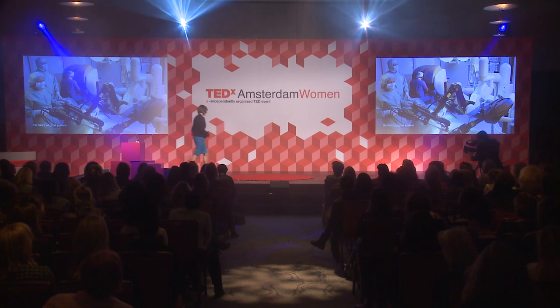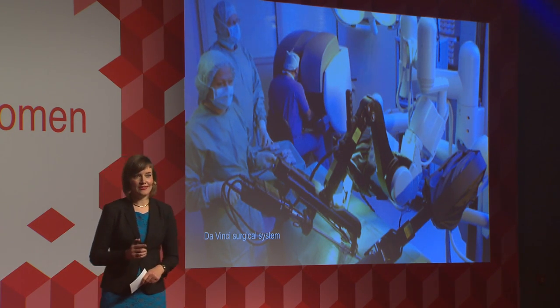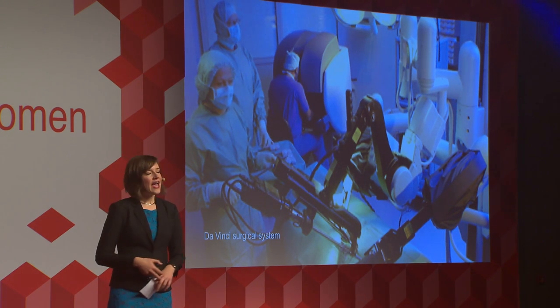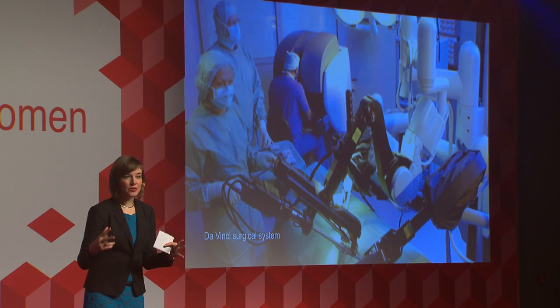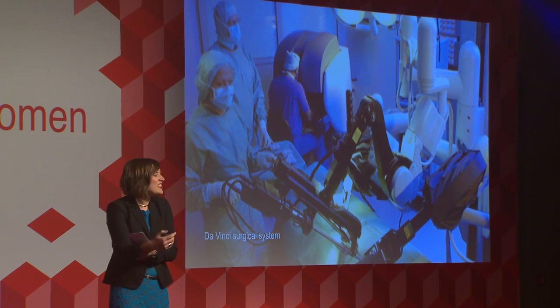Sorry for that. So I got this information, I went back to university, and I studied it. And I found that we needed to reduce operating time, because that would give more patients and surgeons the possibility of actually using these benefits. And the resulting design goals to reduce this operating time were three. One, we should make Sophie small so we could reach patients better. Two, her instruments, we wanted to give her the elbow joint in addition to the wrist joint, so surgeons could work in places that are hard to reach.